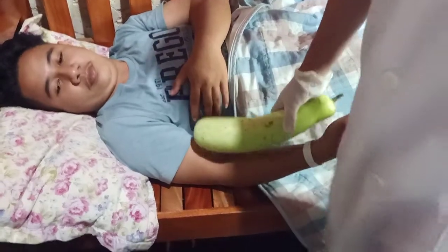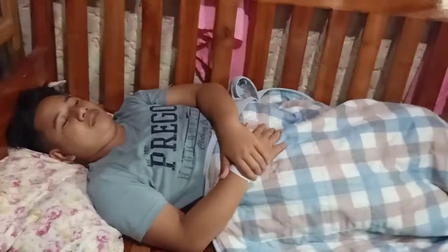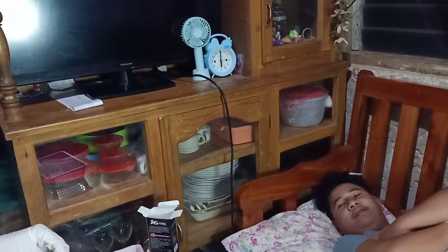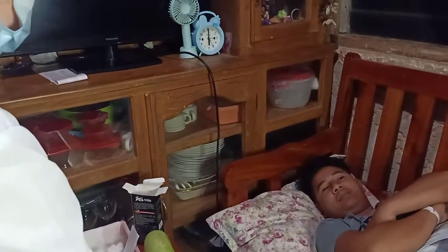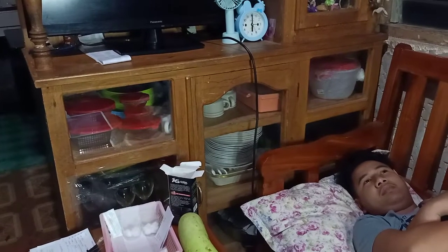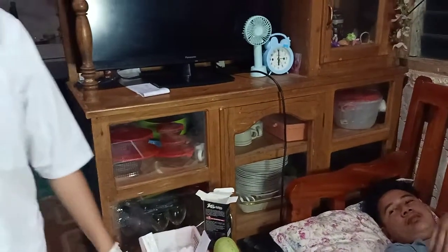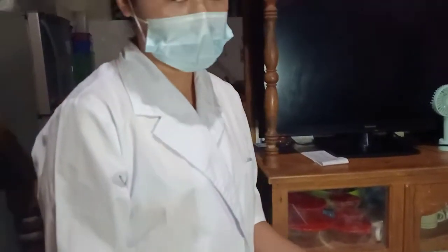Thank you. And dispose of the used needle.